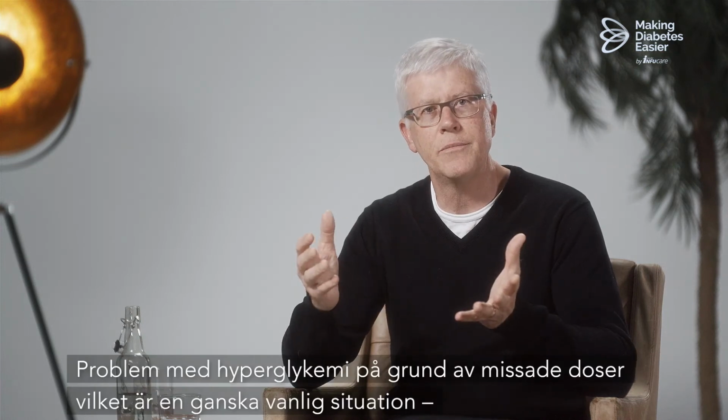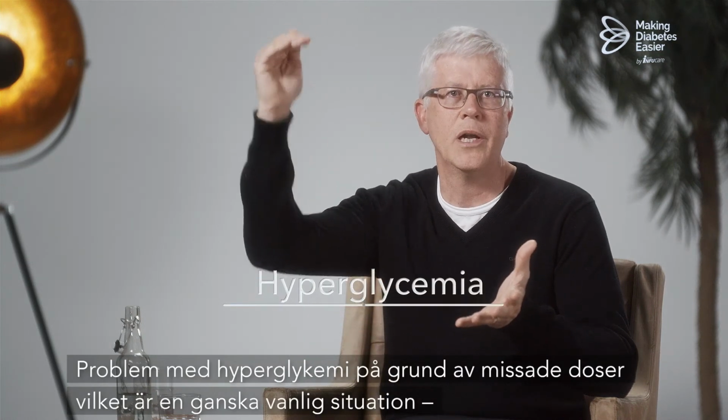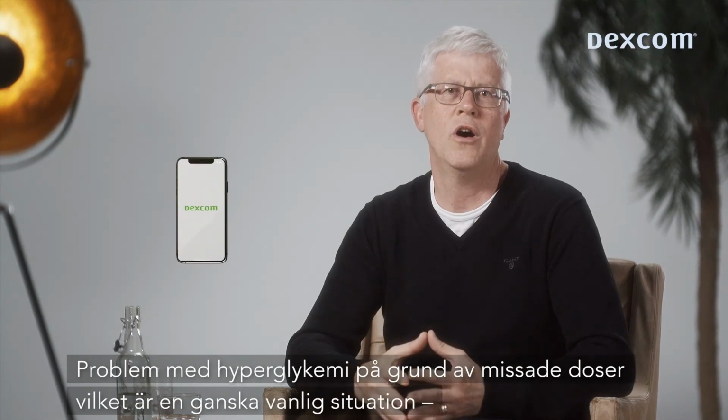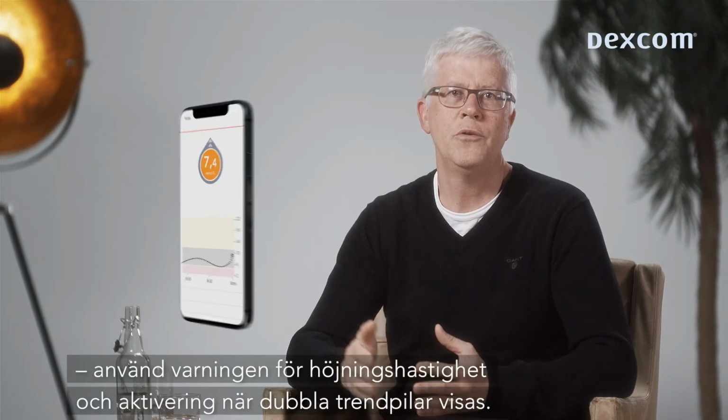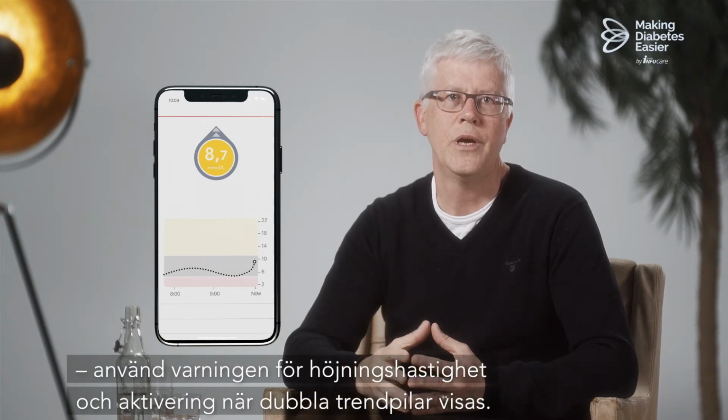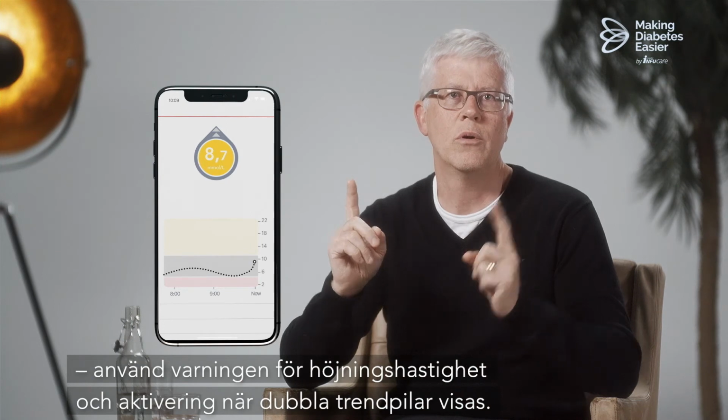On the other hand, if you have problems with hyperglycemia because of missed doses, which is a rather common situation, use rate of rise alert and activate action when double trend arrows are present.